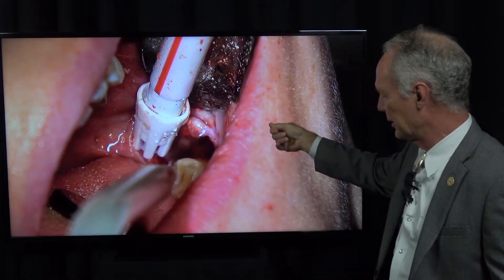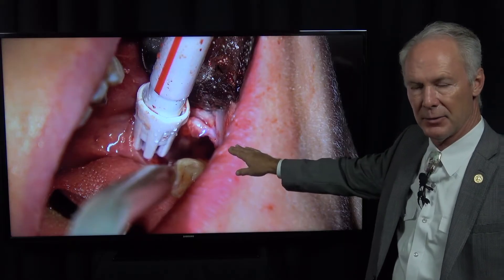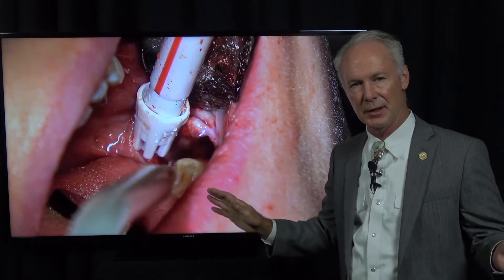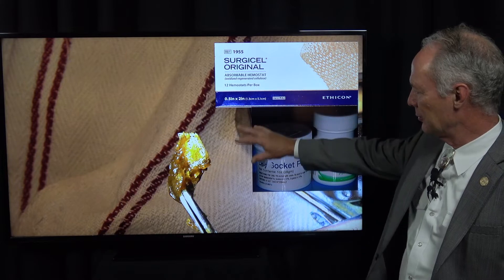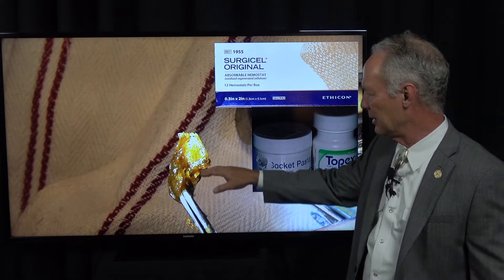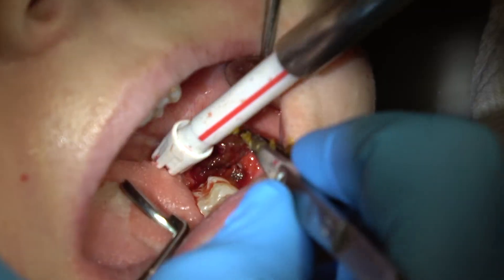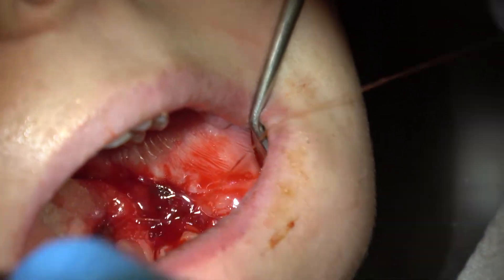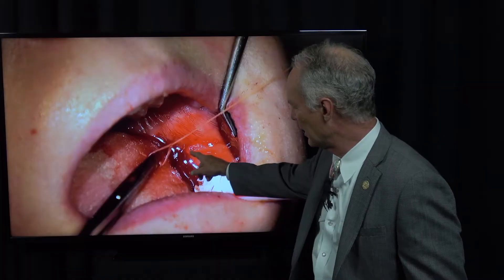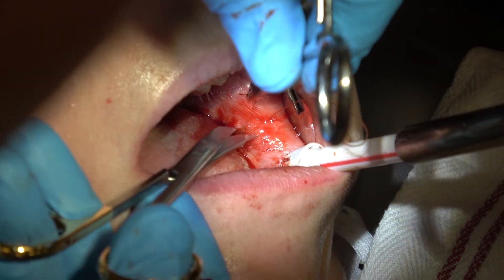Be sure you reach in and remove the follicular sac with the rongeurs, or you may curette. Don't curette the bottom of the apical part of the socket because you want to stay completely clear of that lingual inferior alveolar nerve. Then you're going to pack it with resorbable gauze with the Topex and socket paste, and you will never get a dry socket. Refer to that link on how to never get a dry socket — in 40 years I've never gotten a dry socket. Then I'm suturing with 3-0 gut suture on the mandibular teeth, placing one suture just distal to the second molar and one a little further distally to be sure it's nice and tight.